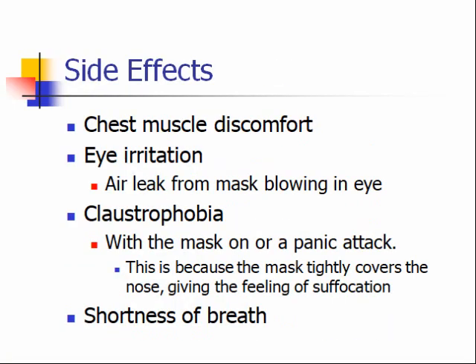Some patients have complained of chest muscle discomfort. Not sure what causes that, but that is a reported problem. Eye irritation can occur, and this especially happens when there's an air leak up by the bridge of the nose. That leak can blow air right into the eye, causing irritation.